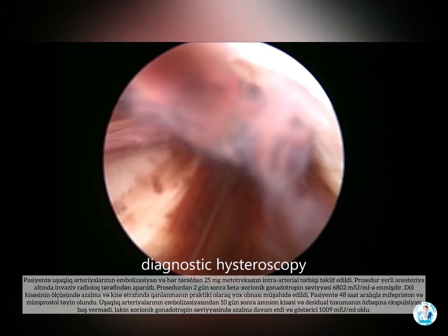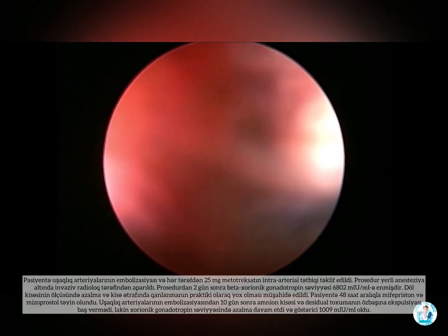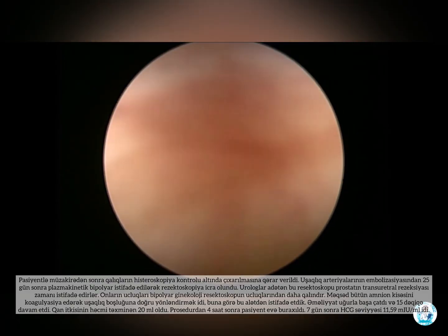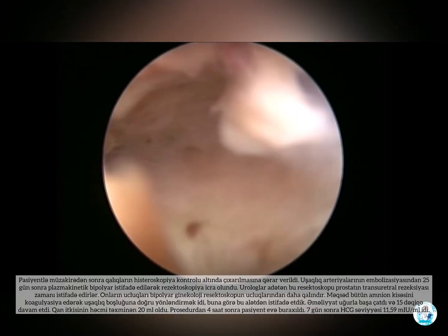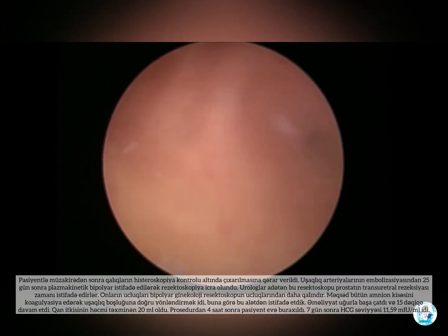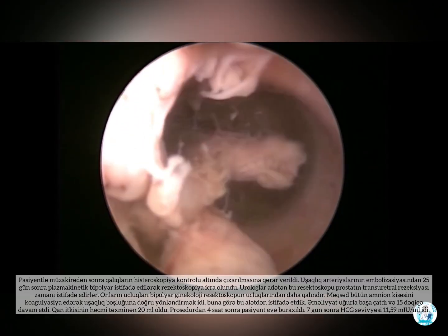10 days after embolization, beta-chorionic gonadotropin was at the level of 1009. 16 days after the procedure, the gestational sac decreased by 1.5 times. There was no active blood supply on Doppler, but there was no expulsion of the gestational sac. It was decided to perform hysteroscopic removal of the remaining fetal tissue.